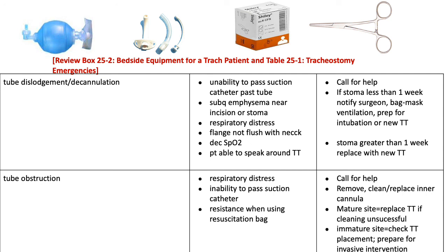That could be obstruction. So things to do would be to call for help. Don't leave the patient. Try removing, cleaning, or replacing that inner cannula.